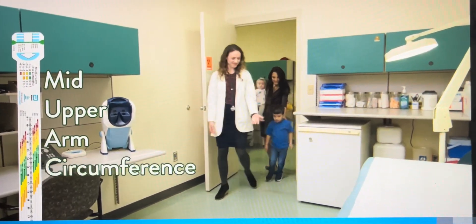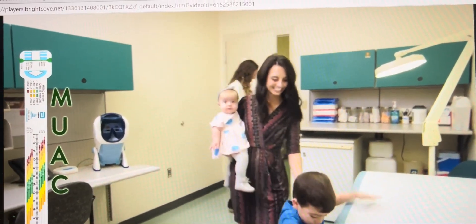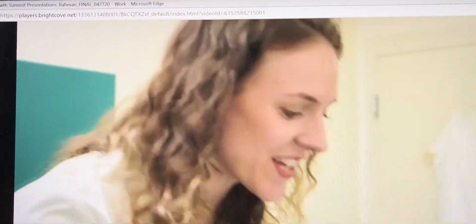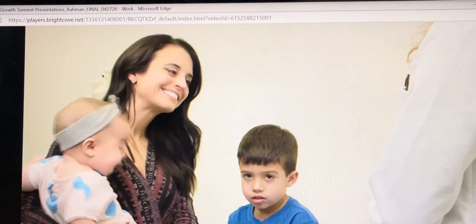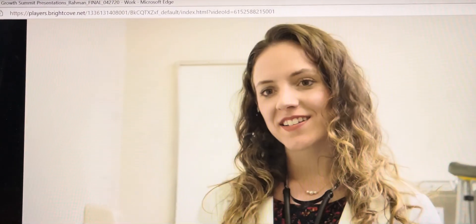Mid-Upper Arm Circumference, or MUAC, is an important anthropometric measurement that can be helpful in identifying children who are at nutritional risk. Mid-Upper Arm Circumference is measured using a non-stretchable tape, such as this one, which has markings to indicate the child's measurement.